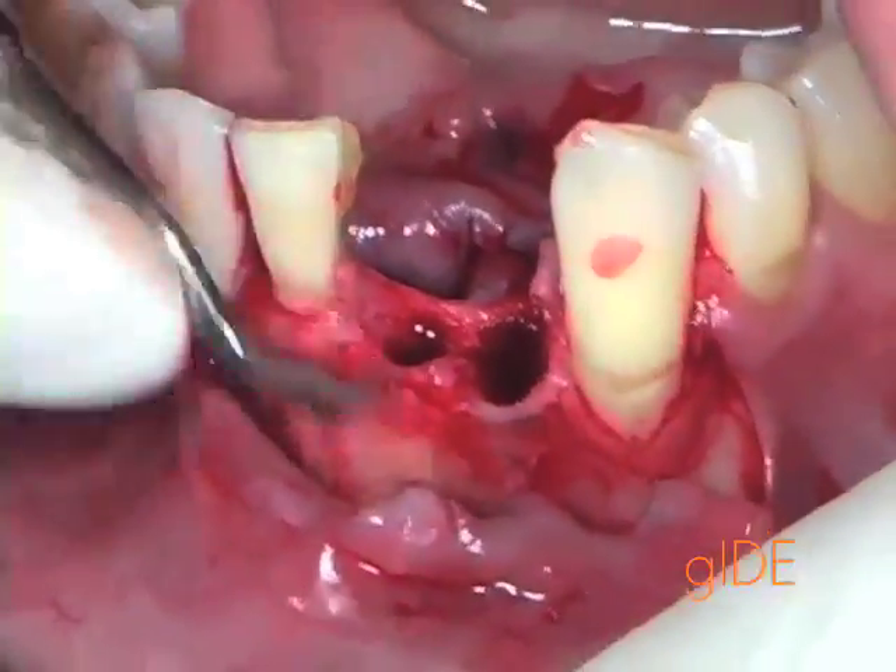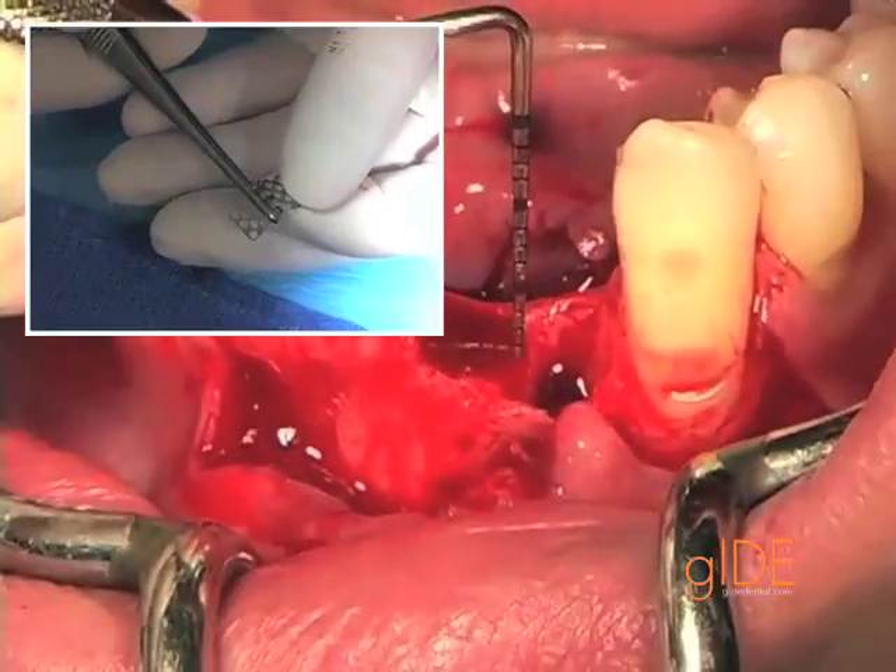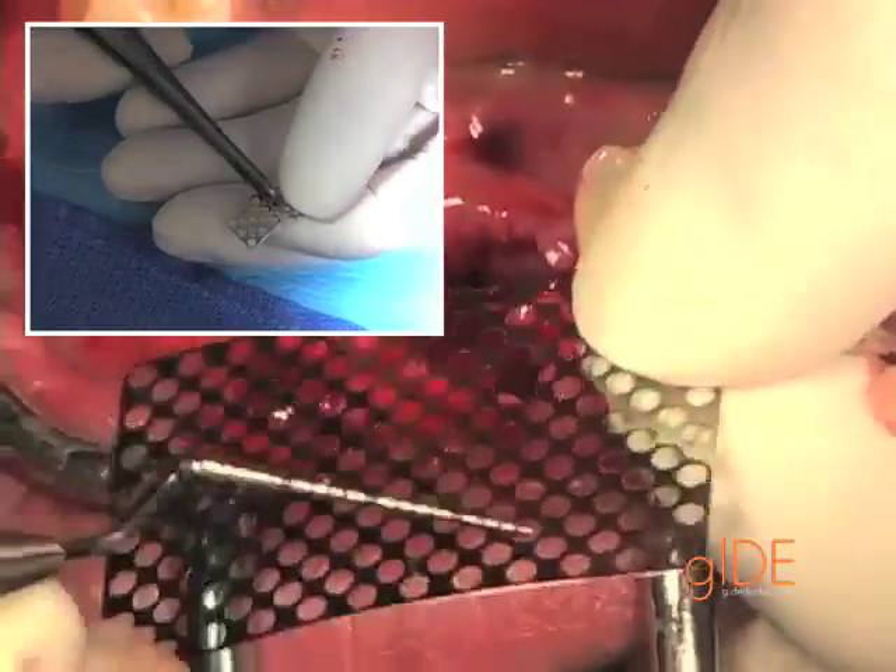The next step, a very crucial part of the procedure, is the preparation of the extraction sites. The titanium mesh is now being prepared.